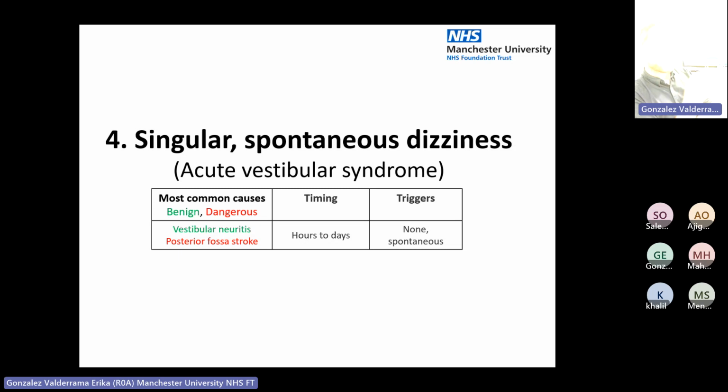But the party line from Emma Stapleton and Simon Lloyd and Simon Freeman is that any dizzy patient that has an ENT request put in needs to be seen by an ENT doctor first. And I think it's entirely possible to do that if you guys feel more comfortable with three things: taking a history, doing a Dix-Hallpike, and doing a head impulse, because that will take care of 90% of patients.